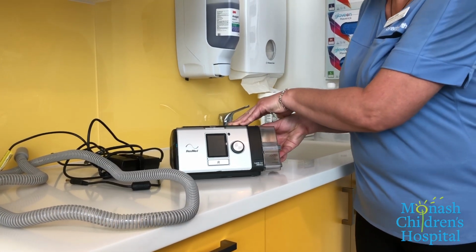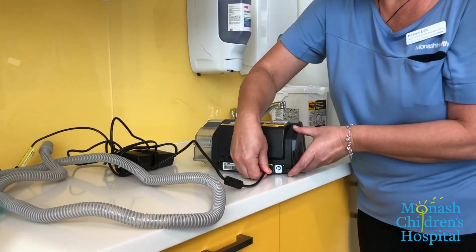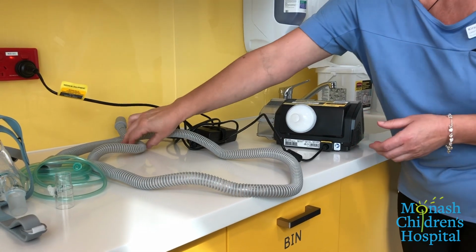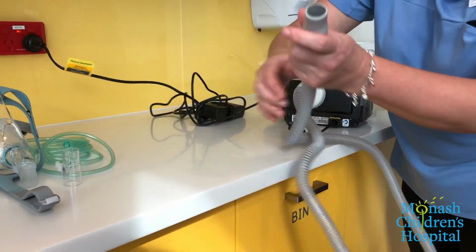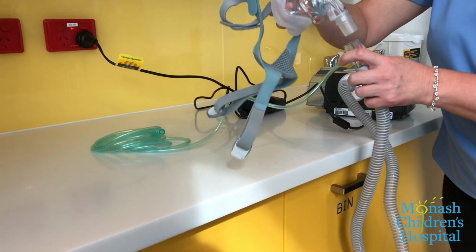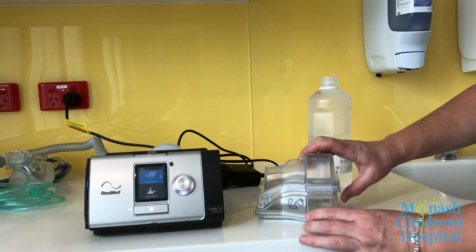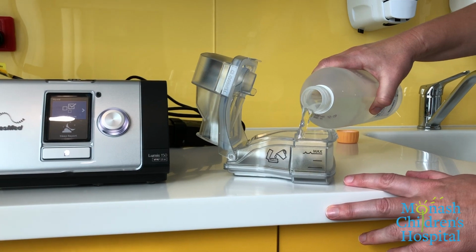Insert the humidifier chamber into the machine. Plug the machine into mains power. Connect all parts of the circuit in order: the filter to the outlet of the machine, then the tubing, then an oxygen port if required, and finally the mask and headgear. Fill the humidifier chamber with water up to the maximum line on the side.